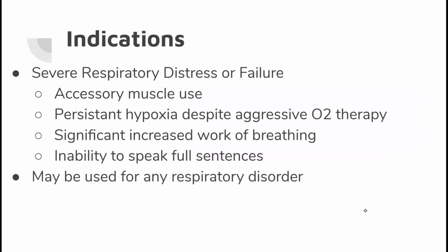It can be used for almost any respiratory disorder if the patient is awake, alert, and doesn't fall into any of the contraindication categories. Like I wouldn't put it in a patient who's got an open chest wound. You're going to cause an issue. If your patient is not completely alert, it's not going to work. Accessory muscle use, persistent hypoxia, even if you're aggressive with oxygen therapy, which can be assisted ventilations. It could be a non-rebreather. Again, you need to look at the patient and make a clinical judgment call here.